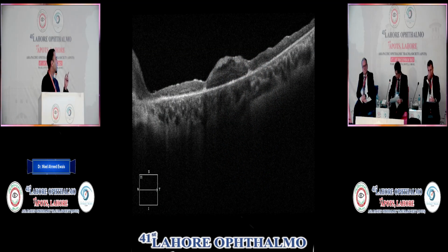This is the OCT that was performed 3 months after the surgery. Well, the graft is filling the hole, a little bit bumpy, because I cannot measure it accurately to have the graft that is equivalent to the diameter of the macular hole and makes it flat. So I thought to have it a little bit bumpy, better than to have adhesions or an incomplete closure of the macular hole.